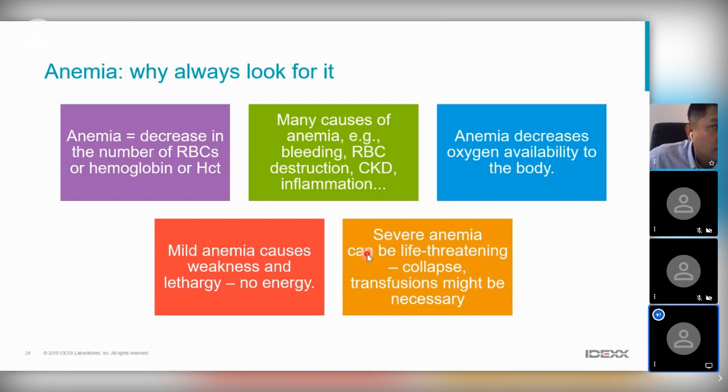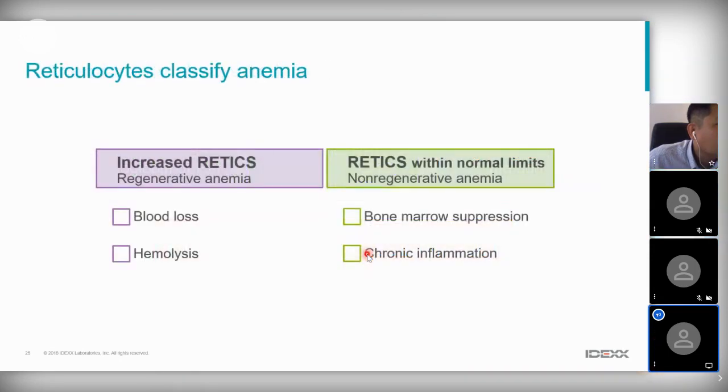And there is a very small percentage that do not use it at all, and some just rely on the blood film. So thank you so much for answering me. I can see that all of you value reticulocytes to a great extent, and they are valuable actually. Over to you, Professor Tan.